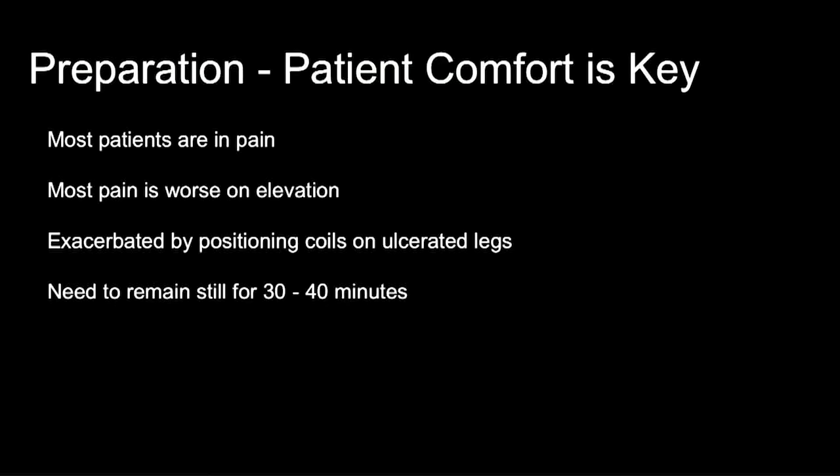So preparation, patient comfort is absolutely key. Most of these patients are in pain. The pain is worse on elevation of the affected limb. That's further exacerbated by placing coils on top of the limb, and although that's better these days as coils are lighter and lighter, despite that, the patients need to lie still for at least half an hour in order to get this, and they have to really stay still and not move.